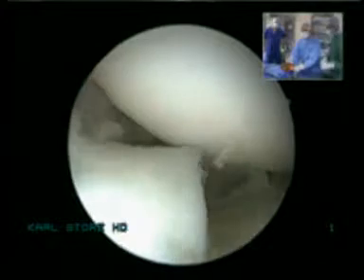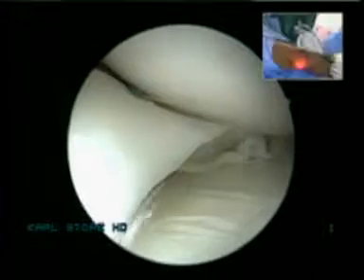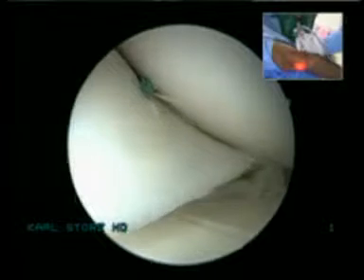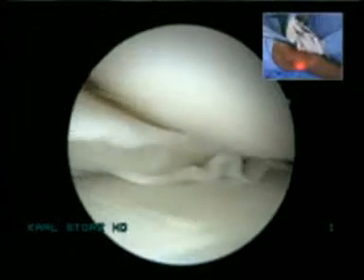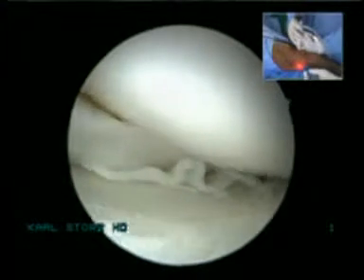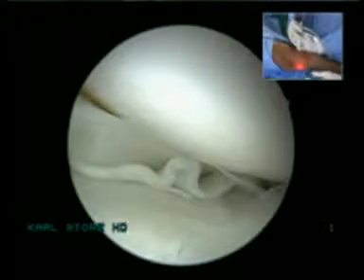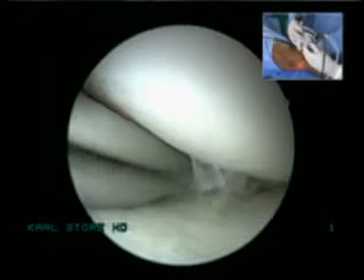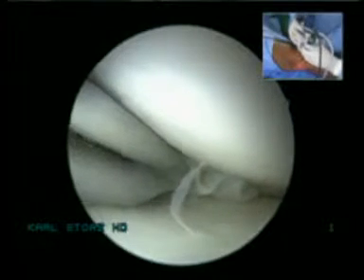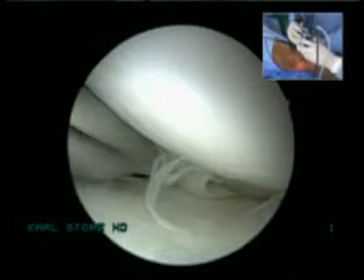Can somebody help me to hold the scope, please? And another one, both things. So Dr. Peterson, if I understand you correctly, you have already put the fast fix device in the posterior horn, have you? Yes, I applied it already. How many fast fixes have you used in the posterior horn? Two. I will use another one maybe later.